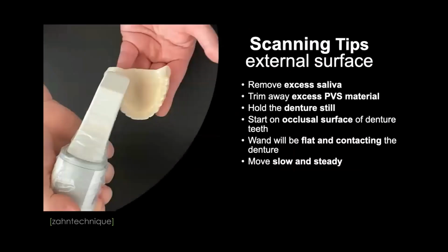So after you use the bite block, the bite registration, and yes, that also can be an old denture. We will discuss this in a few slides, right? We're going to go step by step. In this case, we're assuming that the patient doesn't have anything, just a bare, edentulous ridge. So now that bite registration, right? After you reline it, what Veronica just explained for the soft tissue compression, now you can send it back to the lab. Or you can say, why should I do that? We're digital, I can just scan it and send the scan, right?